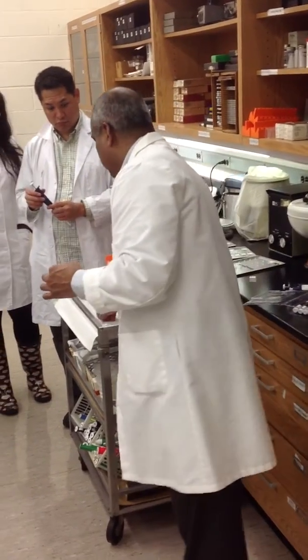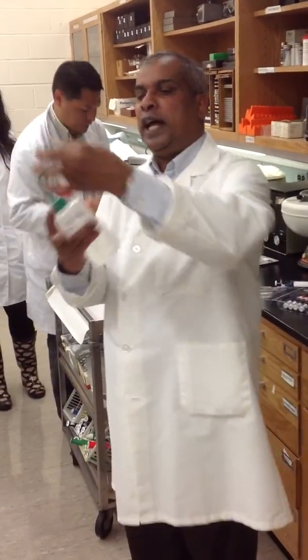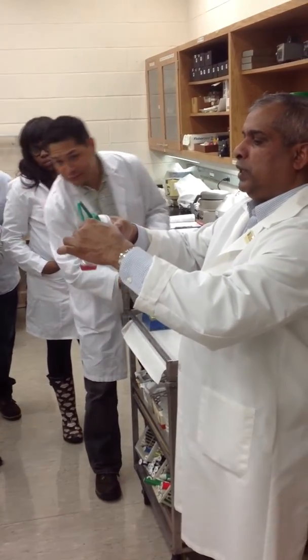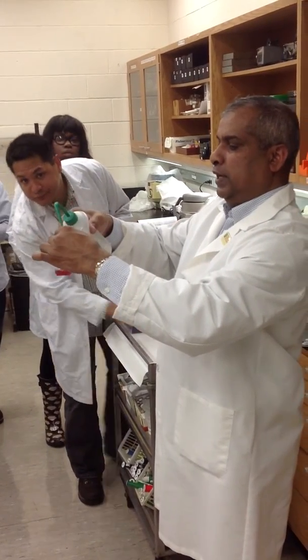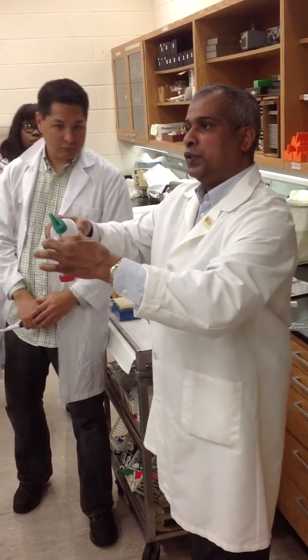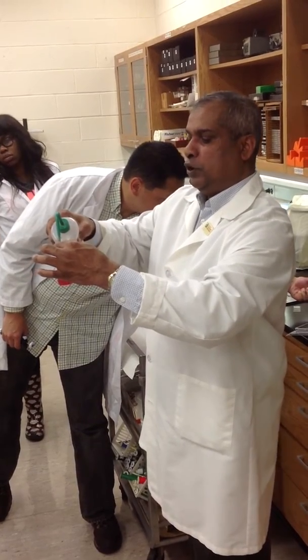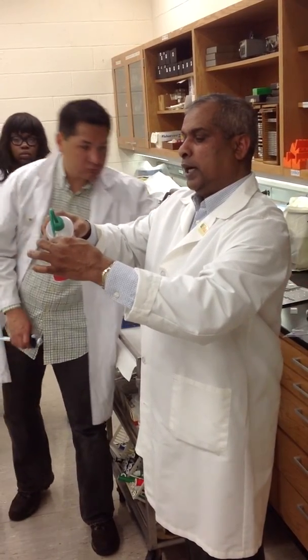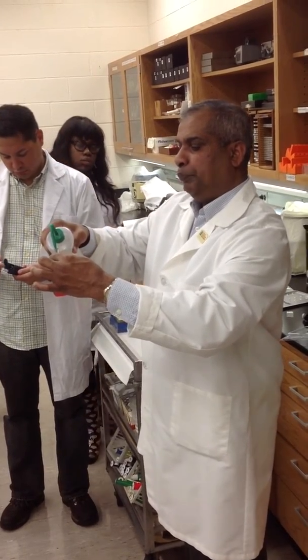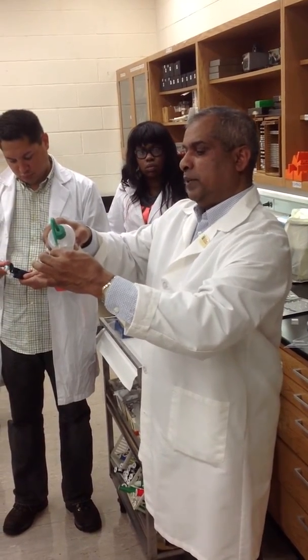Can you close that up for me? So now we have to fill it up. You see the blue line? Everyone see the blue line right there? We have to fill this up now with the rest of it with saline until that line. You don't want to go over. If you go over, what happens? Too much. Do it all over again. You just mess it up, and then you have to do it all over again. Do not pour the blood in here without adding some saline. So it's good to have a little bit of saline in there.